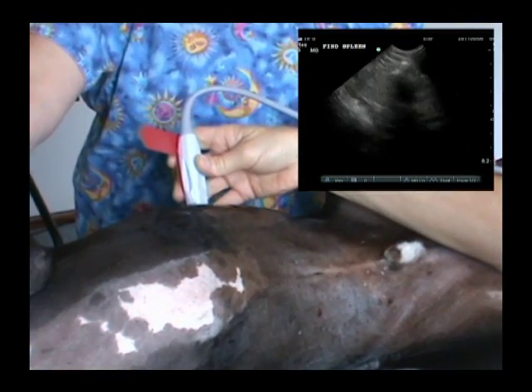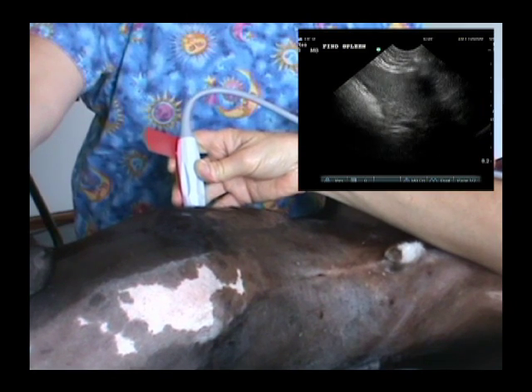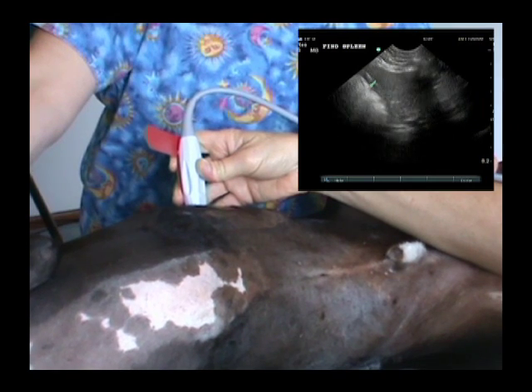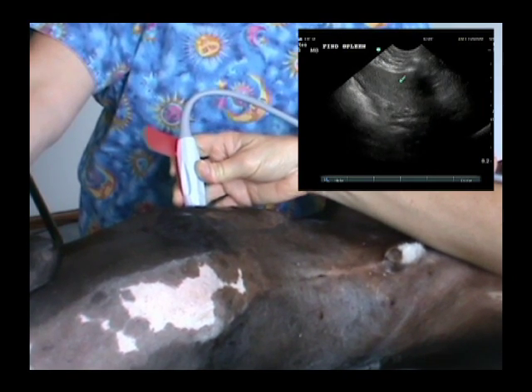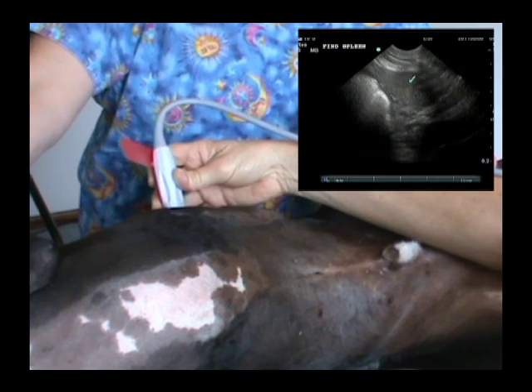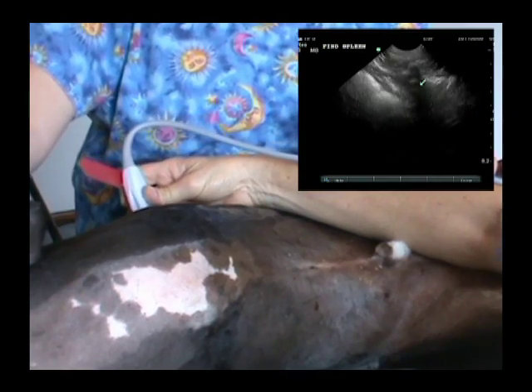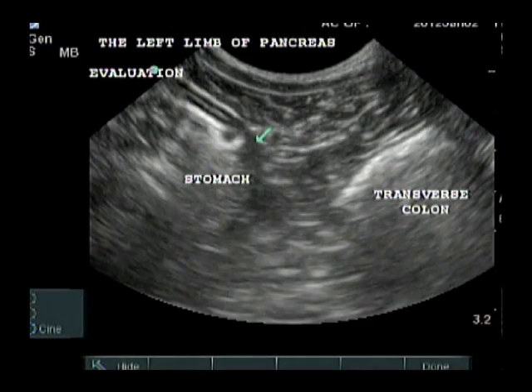We will use all of the skills presented in the Tips and Techniques DVD. In this DVD, we will show you methods of finding the individual organs. We will teach you to evaluate organs for normal appearance. We will show you landmarks to help you locate the organ you are searching for, especially when the organ does not look normal.